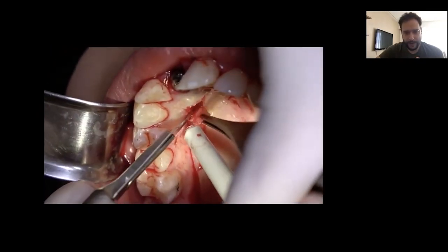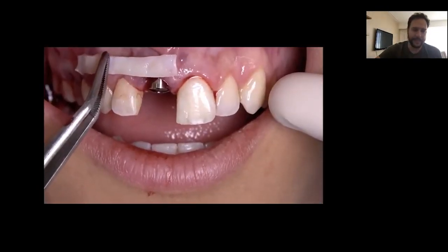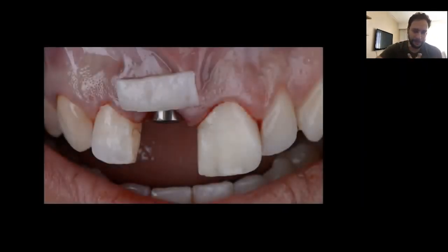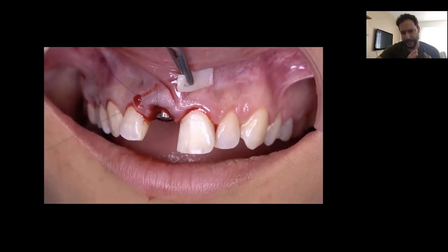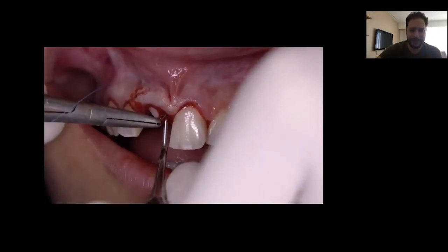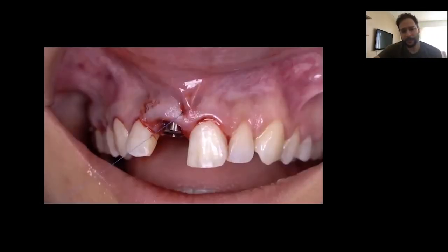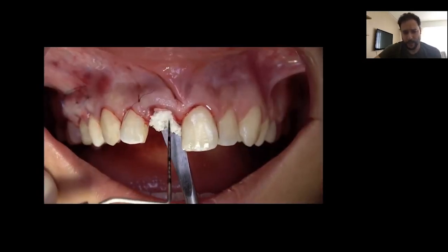We harvest the free gingival graft, which we depithelialize outside the mouth. After depithelializing, we divide what we need for the central incisor — this is the correct shape to augment in the correct position. We don't need large or thick grafts for this case; it is only to preserve the contour. Through horizontal mattress sutures, we use two sutures to stabilize and drive the graft through into the prepared tunnel.